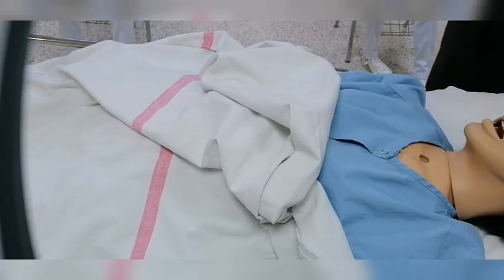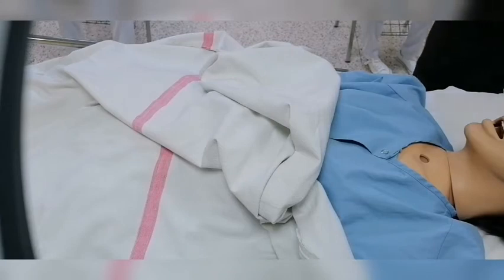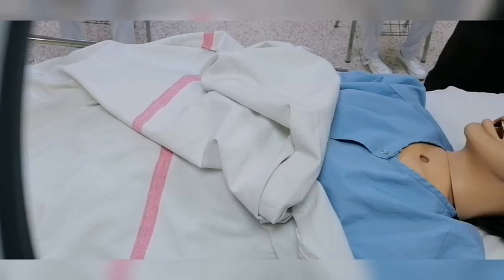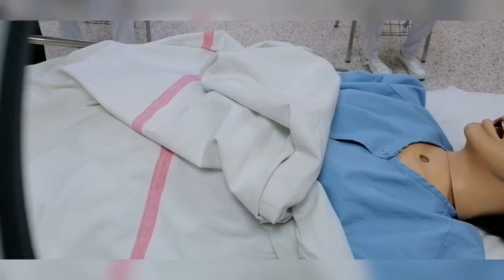When we are planning to do any procedure, what's the first thing that we have to start with? Even before washing hands: assess the injury. How will we assess the injury without coming to the client and opening the previous dressing? Prepare equipment. So the first thing that we have to see is: is there a need for the dressing or not? So you have to verify the need through the client chart.